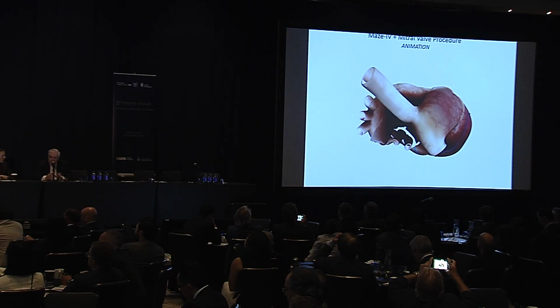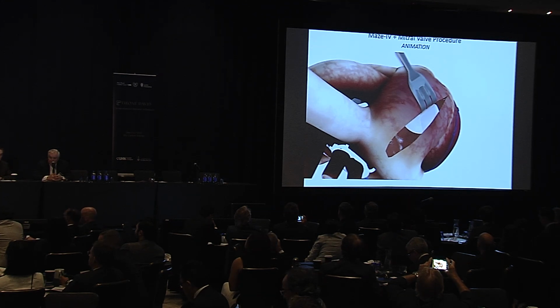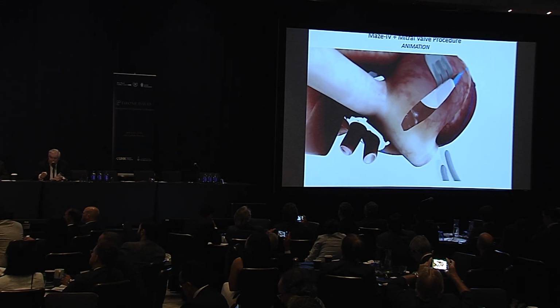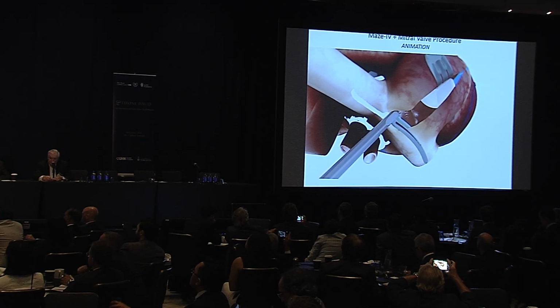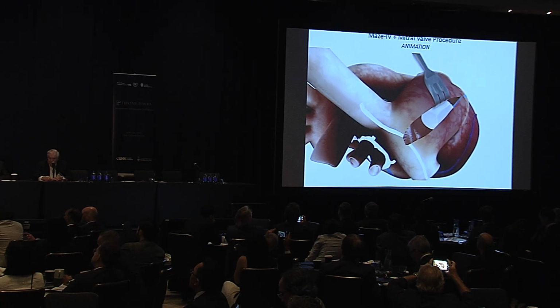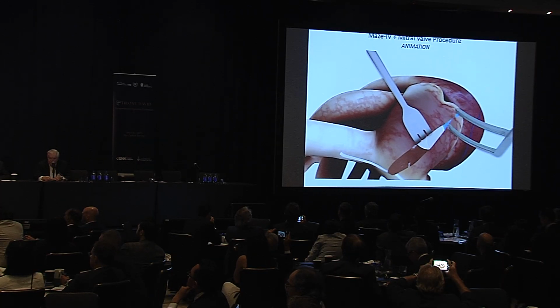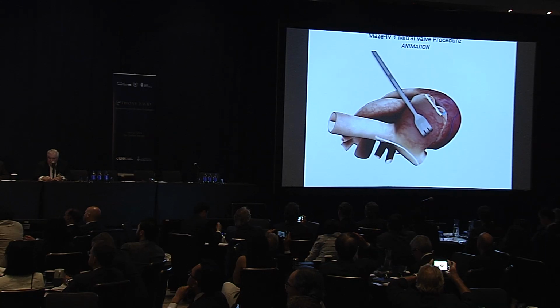So there are a variety of ways of creating these lesions, but there are not a lot of lesions there. On the right side, this is the right atriotomy. I'd put it in a little bit different place, but then you go down to the tricuspid annulus with your cryoprobe. You go from the proximal atriotomy up to the SVC, proximal atriotomy down to the IVC. That gives you your intercaval lesion. And you've got one more lesion that I told you about that I put in and Patrick doesn't. That doesn't seem to make much difference, and that's from the distal atriotomy up the atrial appendage. And you're finished. That's it. So that's how you do it.